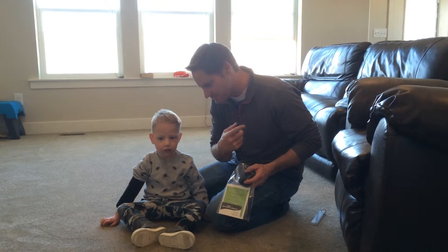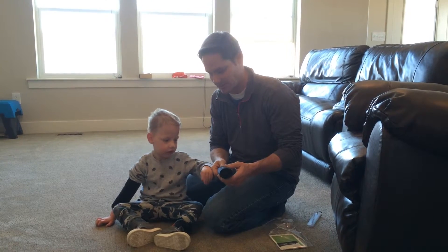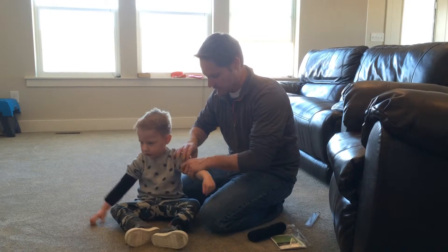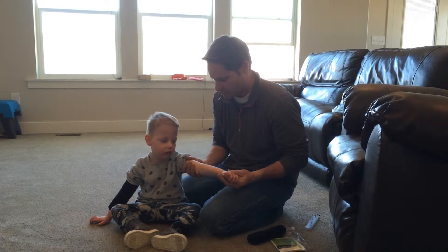This is Bronson. Say hi, Bronson. Hi. We're going to put Bronson's other bamboo brace on today. He's wearing a medium size and he has spastic quadriplegia.